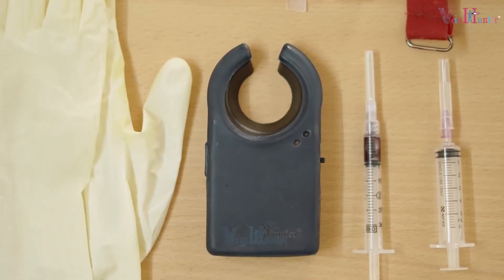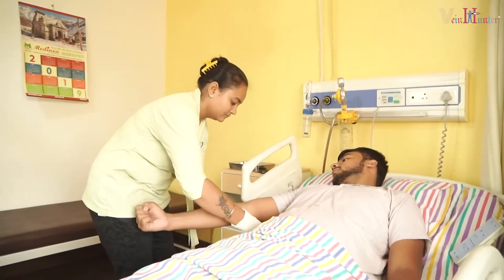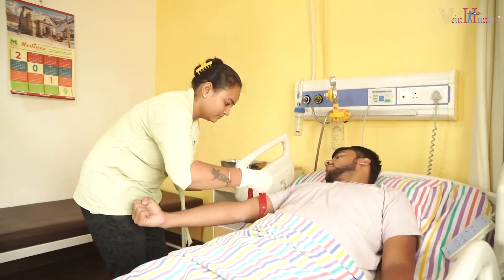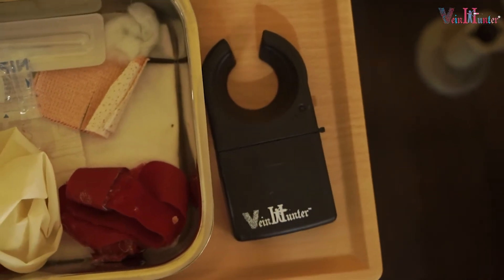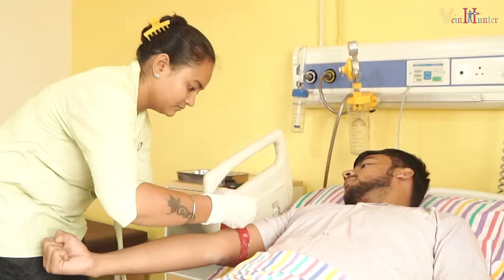How to use Vein Hunter in real life? Because of some medical condition, sometimes it's hard to find a vein on a patient's arm. We are coming with this product that helps you find the accurate vein, which increases confidence of the nurse and reduces patient's discomfort.